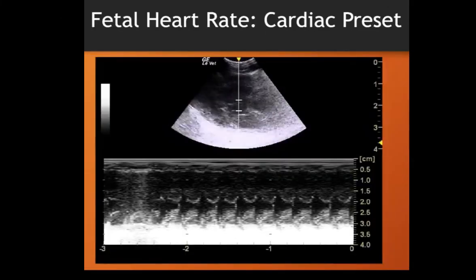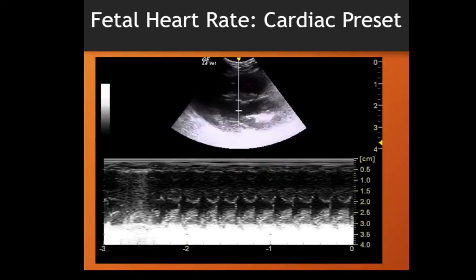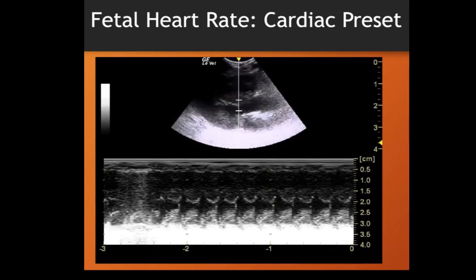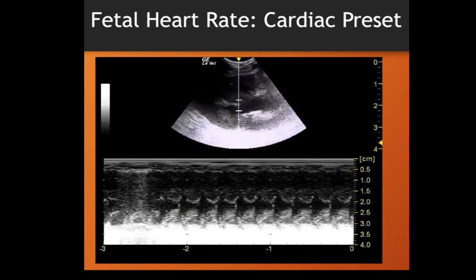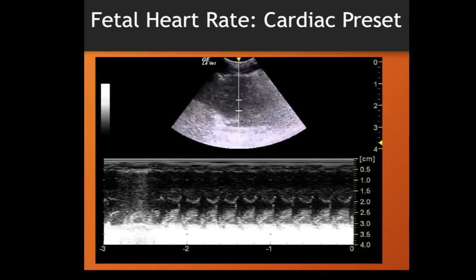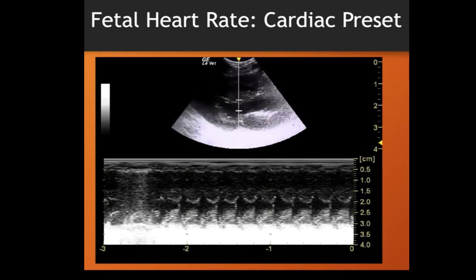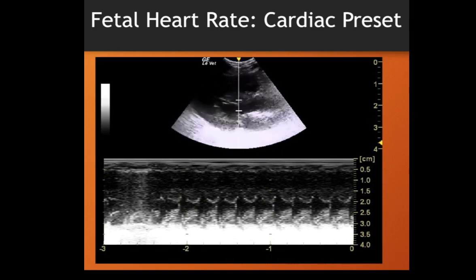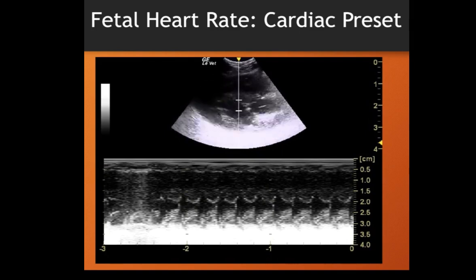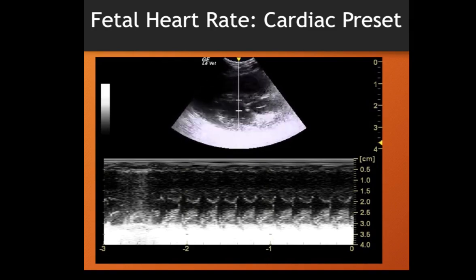Step number one: you want to identify the fetal heart and zoom it in. You want the heart to look as big as possible so that you may get the most accurate readings. In this particular video, I'm actually using an adult heart as an example; with the abdominal preset, I will do the measurements on actual fetal hearts.